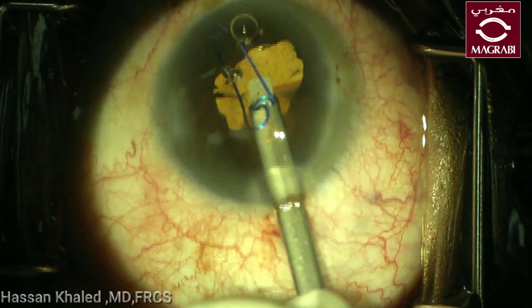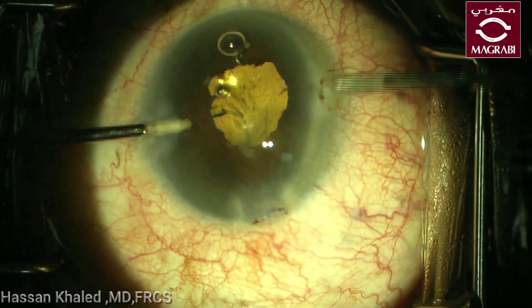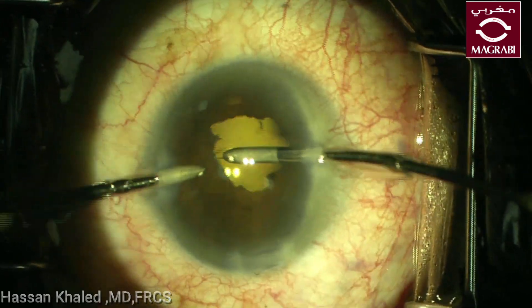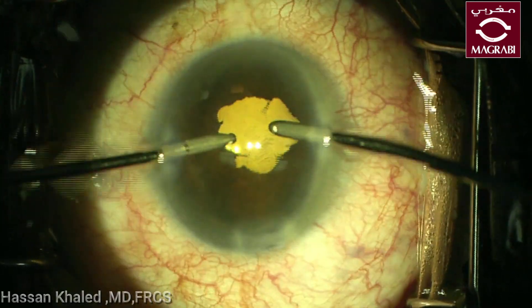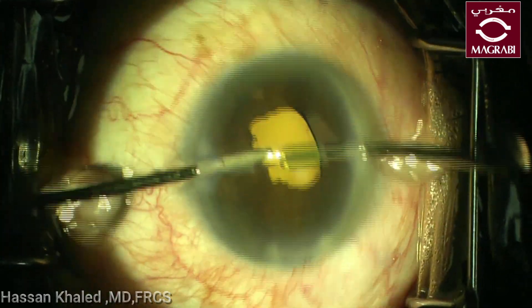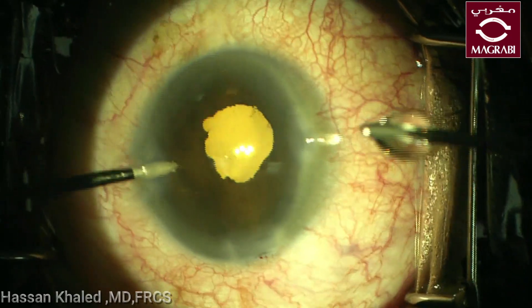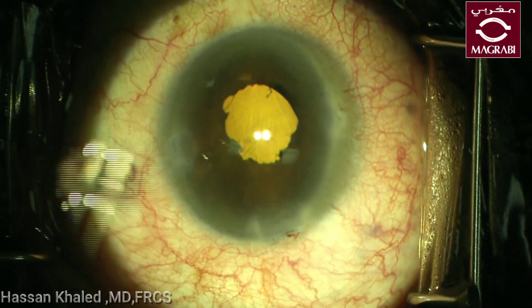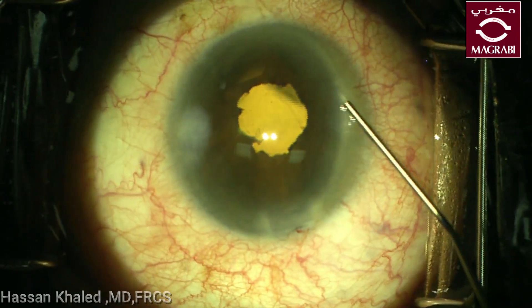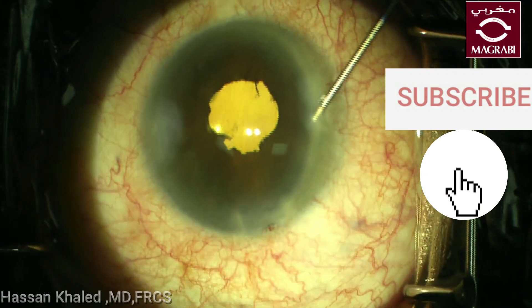You can just release the two eyelets and then remove it from the anterior chamber, then wash the OVD from the anterior chamber and also behind the IOL. Here you can see the pupil is becoming irregular, but the surgery went smoothly and it was a very good result by the end of the surgery. Then doing stromal hydration.